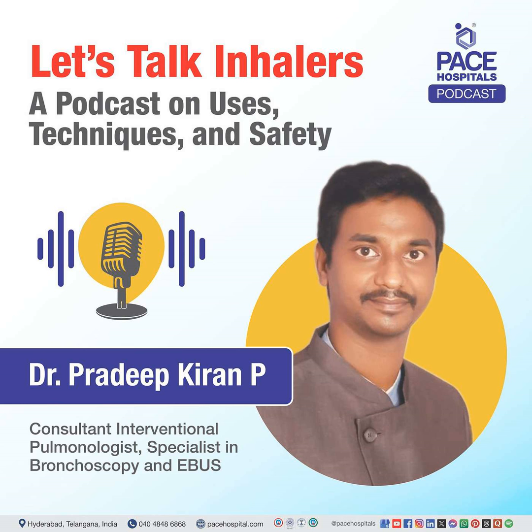The first step is remove the cap. After removing the cap, you can see there's a chimney like tube here. This helps in our inhalation process. Now, you can see there is an arrow here. This arrow indicates that this needs to be turned. So, once you turn this one, you can see that the DPI machine has opened, and you can see a space. There's a space for a capsule.